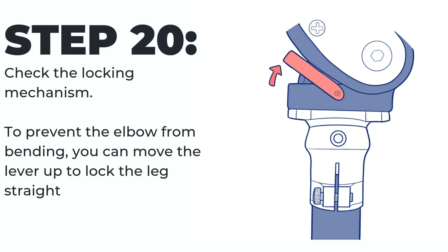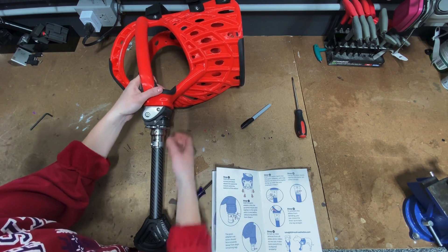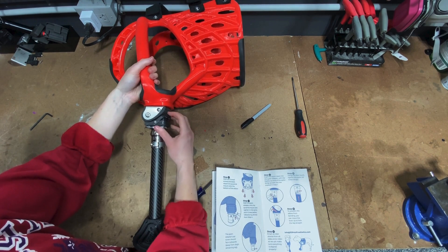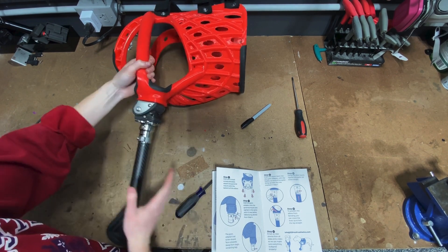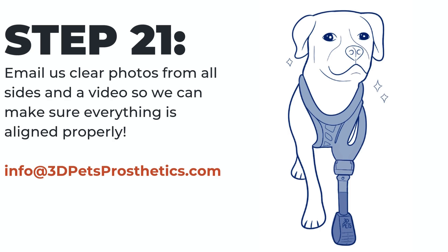Step twenty: check the locking mechanism. To prevent the elbow from bending, you can move the lever up to lock the leg straight. Step twenty-one: email us clear photos from all sides and a video so we can make sure everything is aligned properly.